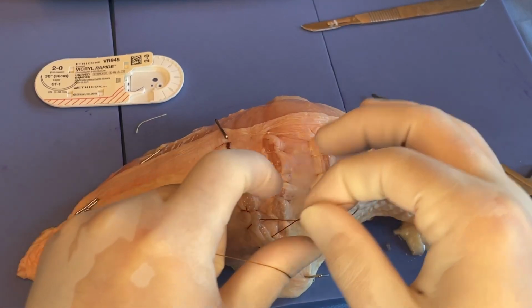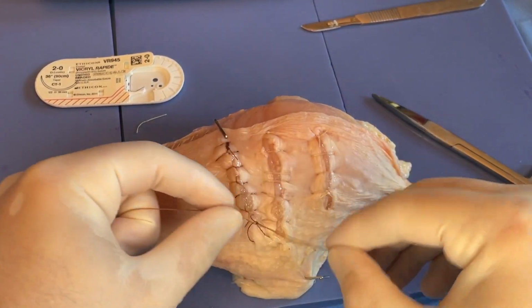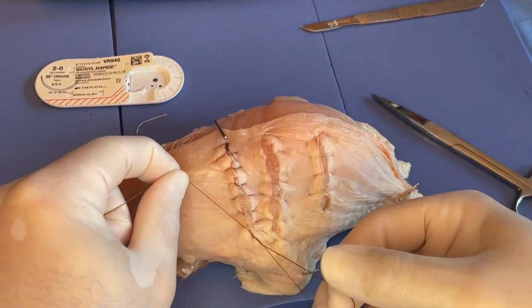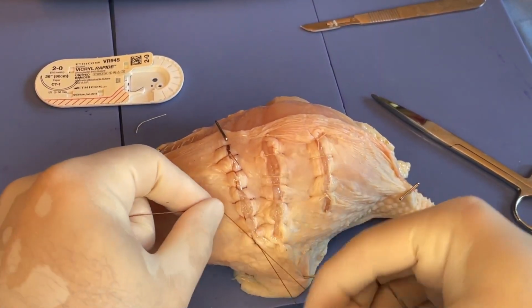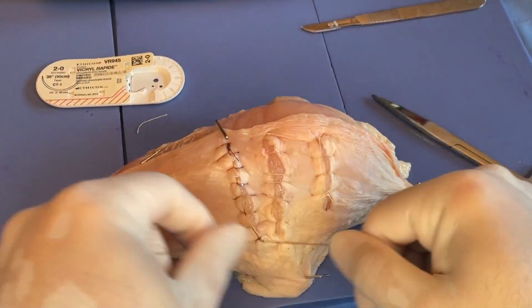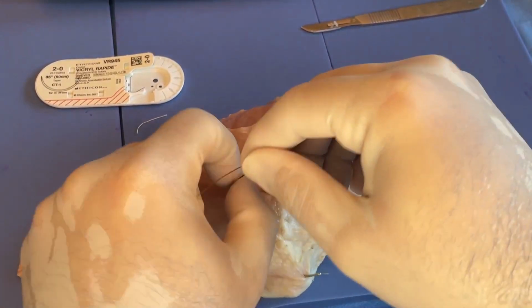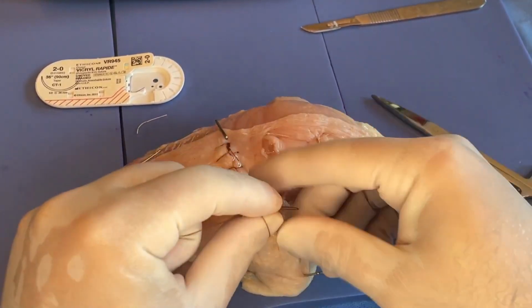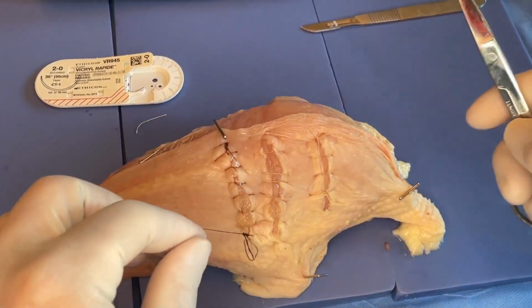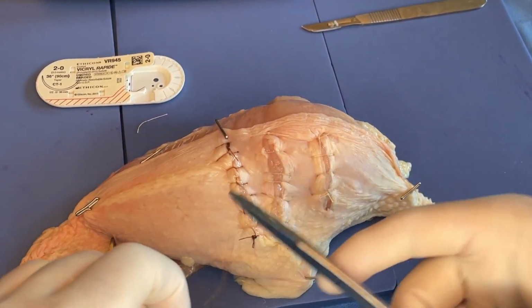Two-handed knot. So wrap it over thumb, bring this over again, as if it were a single strand, bring it through, and then tie it down. One thing that a lot of folks do is that they'll work this loop back and forth a little bit to make sure that it's snug, that it's evenly pulled through. So over the finger, keeping some tension there. And then I got a little bit of an air knot there, over thumb and through finger, through. You can do a couple extra here, thumb, finger, like that. And now we've got three pieces of suture, two here in the loop and then the single strand, to cut through, like that.